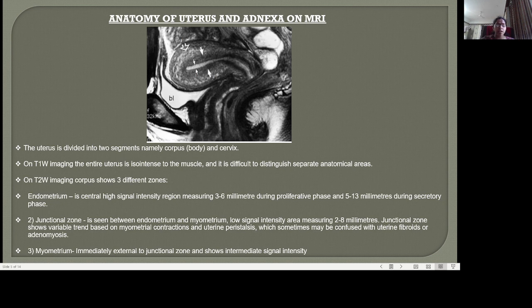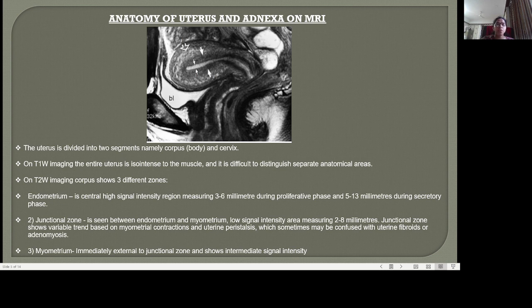Regarding the MRI anatomy of the adnexa, ovaries are better visualized in pre-menopausal women. They show high signal intensity follicles on T2-weighted images and the medulla appears as an intermediate signal intensity area. Ovaries gradually atrophy with age in post-menopausal women. During the pre-ovulation phase they reach maximum size with an enlarged dominant follicle, and the medulla shows high signal intensity on T2 due to edematous vascularized stroma — this may also appear bright on DWI, a phenomenon called T2 shine-through. The fallopian tubes are approximately 10 cm long within the superior portion of the broad ligament, and normal tubes are not routinely visualized.